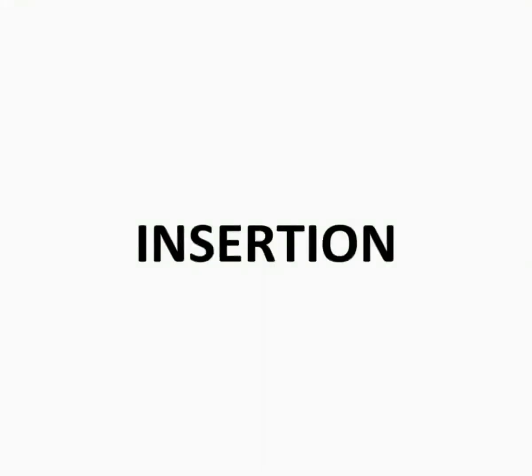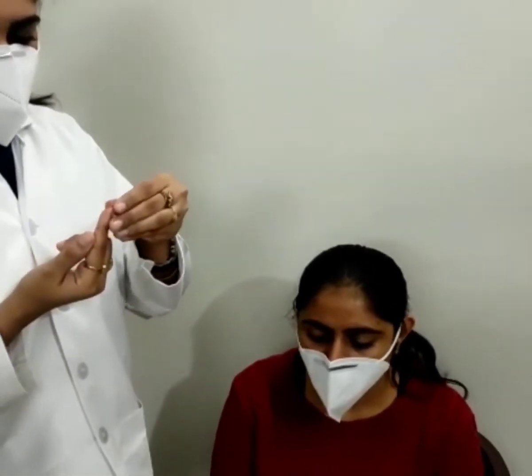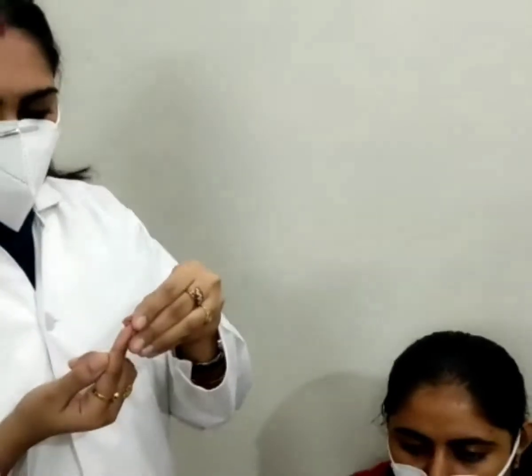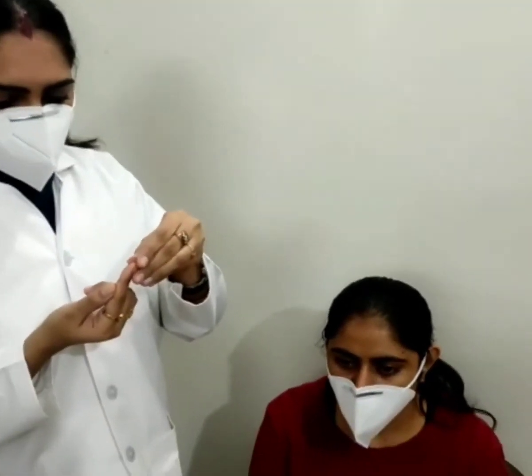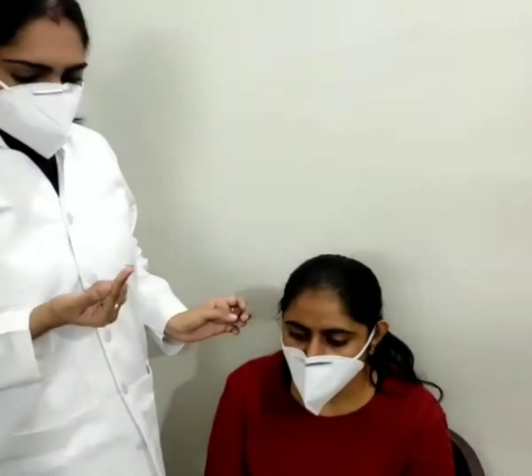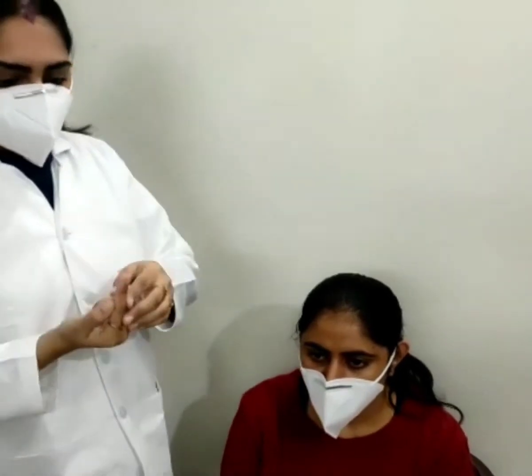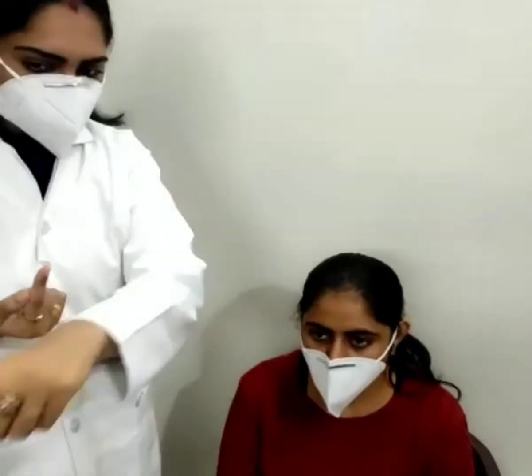The next step is insertion. Always apply the right lens first to avoid mixing. Stand to the side of the patient. Place the lens on the tip of a dry index finger. Now instruct the patient to fixate at an object in the straight ahead position.